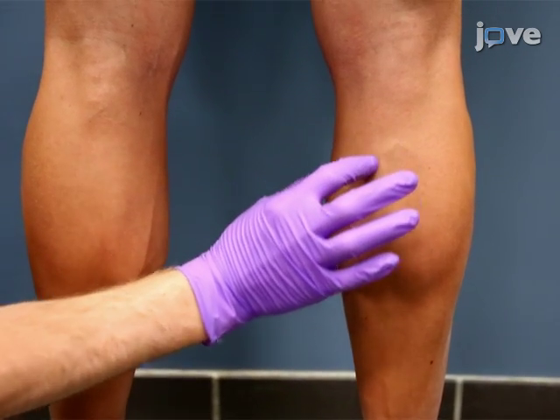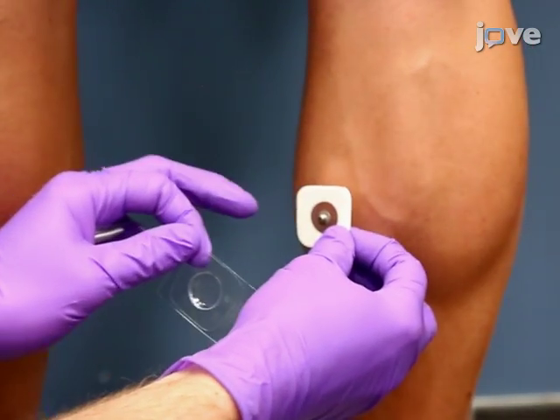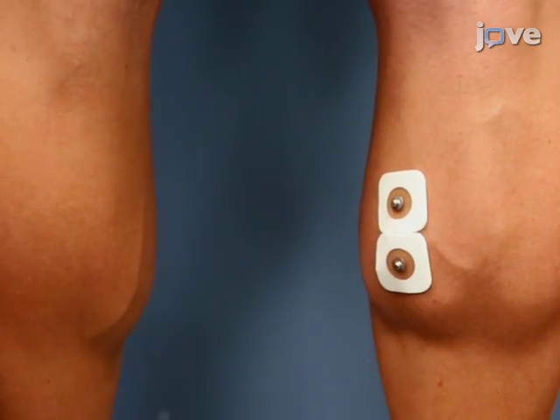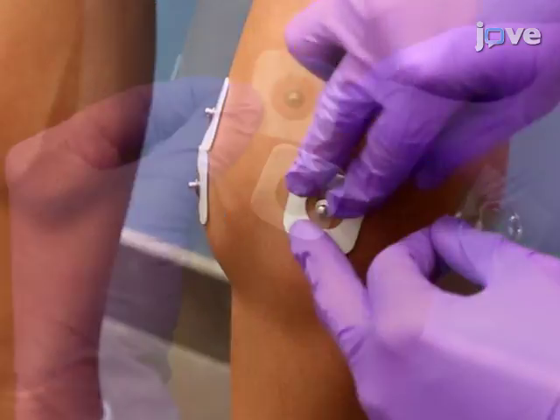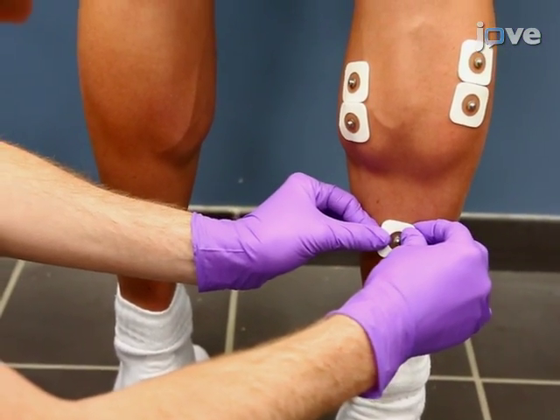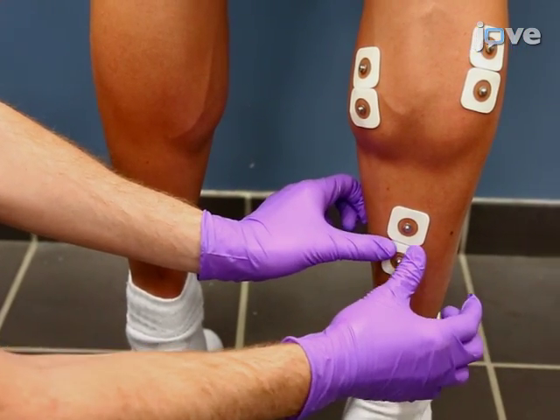Ask the participant to stand tiptoe to clearly identify the plantar flexor muscles. Place two 10 mm silver chloride surface electrodes about 2 cm apart on the prominent bulge of the medial gastrocnemius muscle. For the lateral gastrocnemius, place two electrodes at one-third of the distance from the head of the fibula to the heel. For the soleus muscle, place two electrodes at two-thirds of the way between the medial condyle of the femur and the medial malleolus.